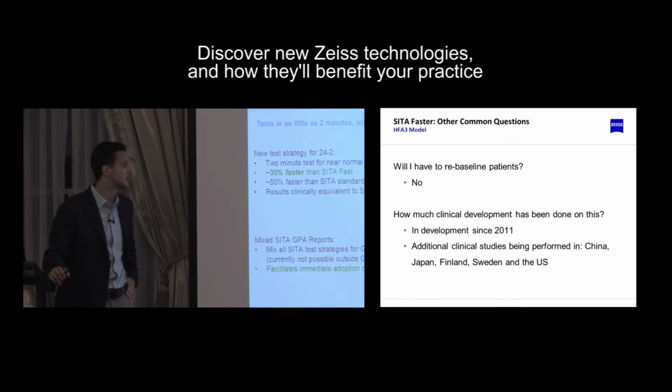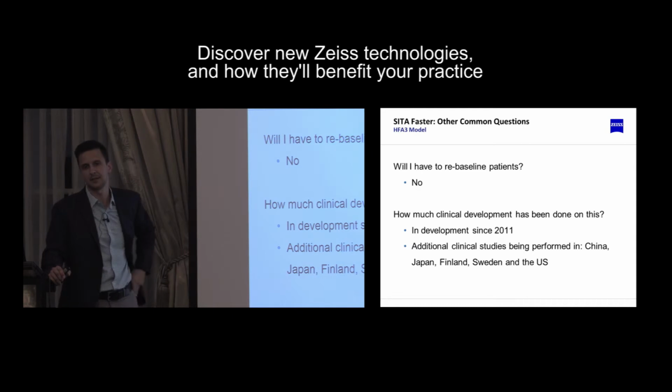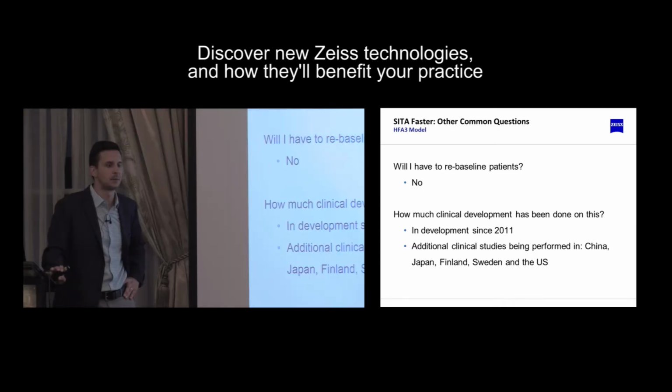Now here is the really nice thing about it. Do you have to rebaseline your patients? Easy answer, no. In an HFA3, Sita fast, Sita faster, and Sita are all talking to each other. So if you've been doing Sita for a long time, or you've been doing Sita fast, and you're worried, I don't really want to go this route because I've got to rebaseline all those patients, you don't have to worry about that. Its equivalency from a testing standpoint is there, and it's comparable data over time.